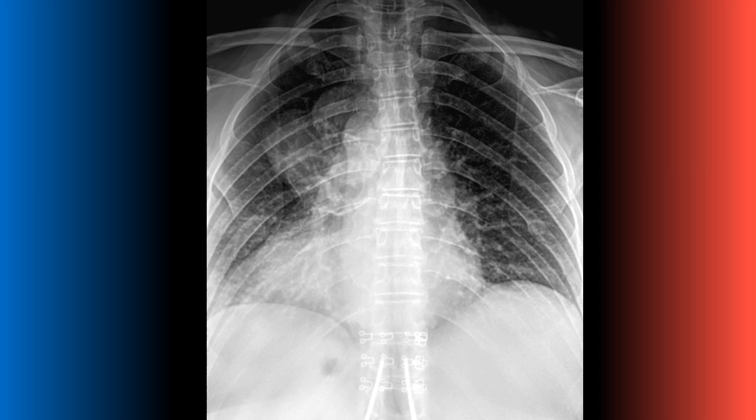On this frontal view of the thoracic spine, in the left hilar region of the chest you should see a large area of increased density that demonstrates no evidence of calcification. This was proven by CT scan to be bronchogenic carcinoma.